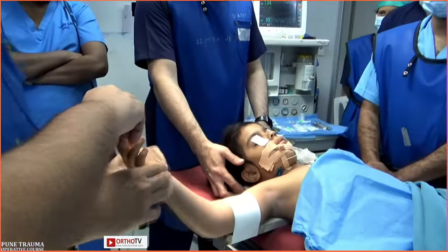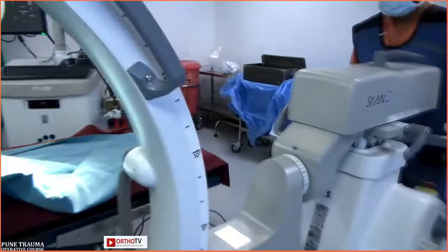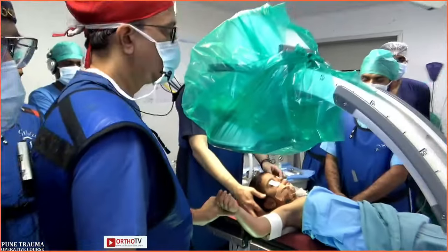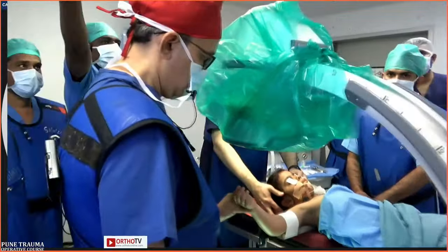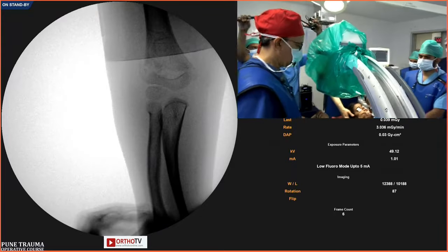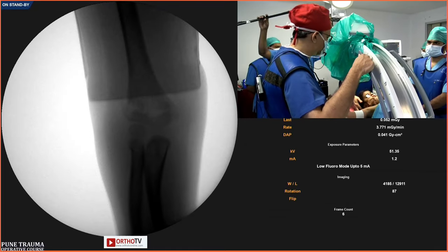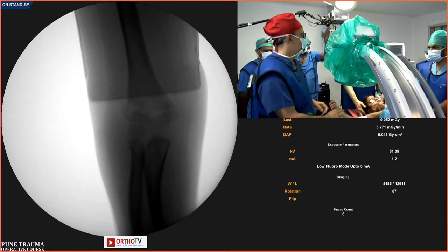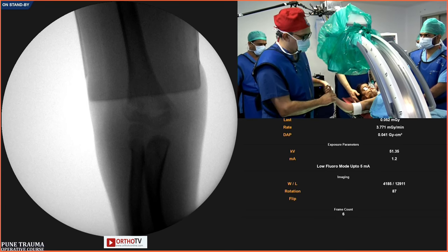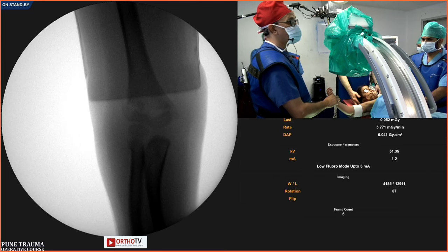Now against that, I can bring in the C-arm. Sandeep, there is a suggestion here that there is a person stabilizing this arm board from the other side. If you have a lateral support and apply that, then that person can be relieved of shoulder pain in future. No, the problem is that I have 3 residents. I need to give them some work. The board is actually under the patient. The body weight of the patient won't allow it to move. All right, but we must make use of our resources.